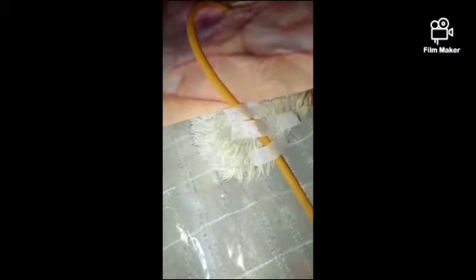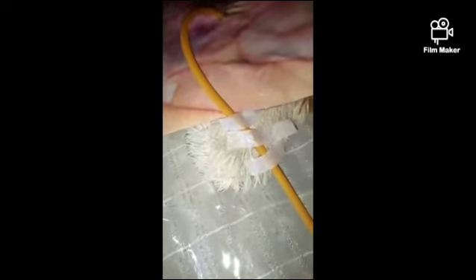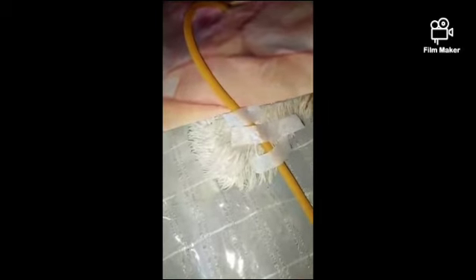Remove the syringe and discard. I assume that this is the thigh of my client, and tape the catheter to the thigh to avoid reflux of urine to prevent infection.